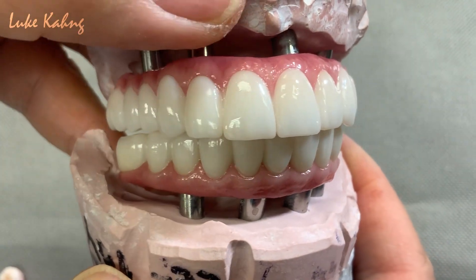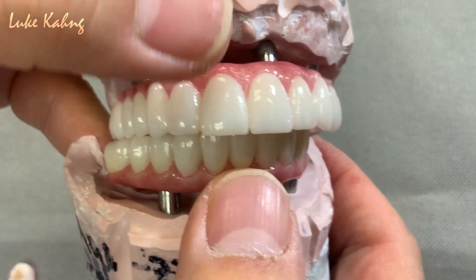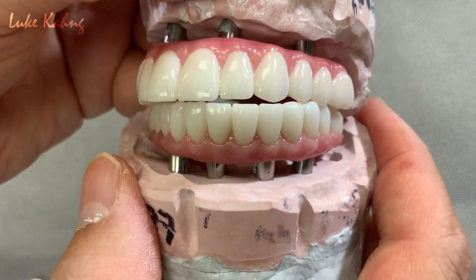One, two, three — okay, this is two-piece, and then end of the one-piece. This is literally one piece. Let's finally finish it. All right, thank you.